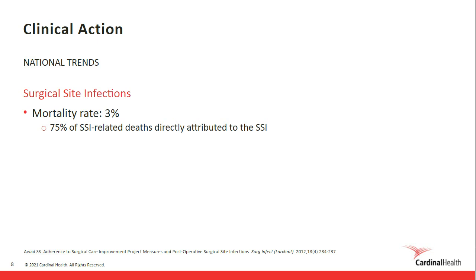Well, the answer is to limit exposure to pathogens as much as we can. As bedside nurses and providers, we do that through hand washing, universal precautions, rigorous cleaning protocols, and through sterile procedures. We can also be more thoughtful when using medical devices that we know are associated with infection. The CDC 2019 National HAI Progress Report found a 3% decrease in central line device utilization and 7% decrease in urinary catheter utilization. This aligns with the decrease in CAUTI and CLABSI I shared on the previous slide.